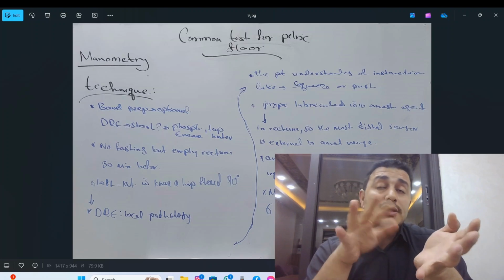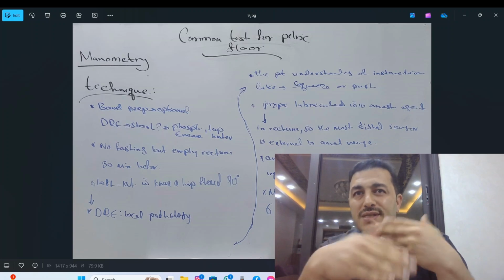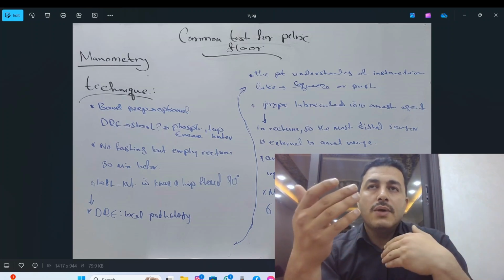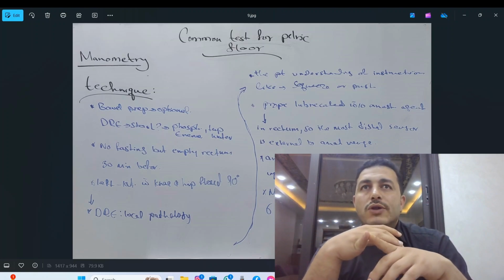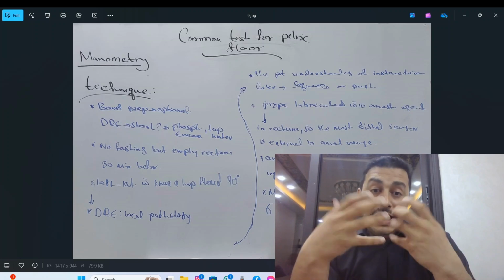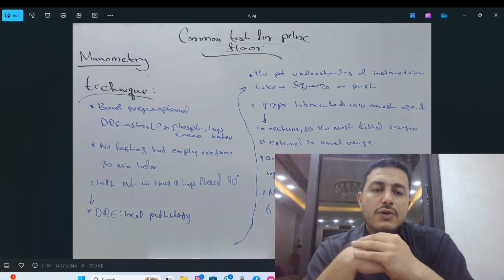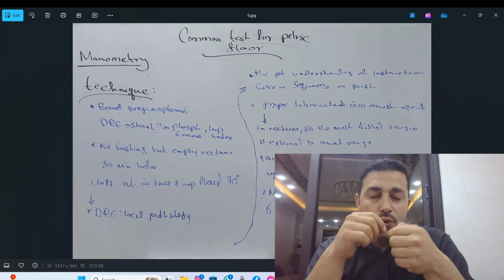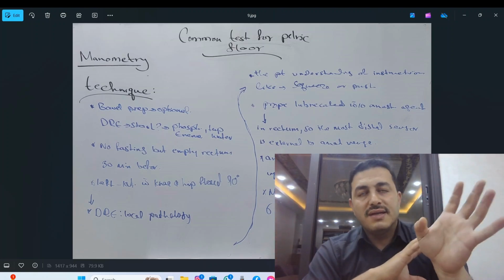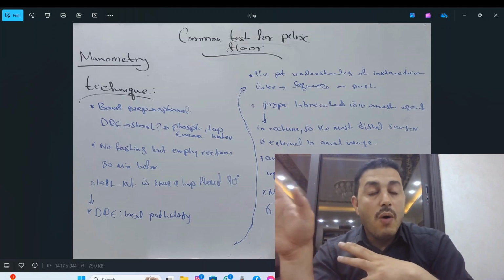The patient is positioned in the left lateral position with the hip and knee flexed. Before starting, we should share a common language with the patient. We should tell him what we mean by squeeze and what we mean by stimulating defecation, so we explain and give some instructions to the patient. The probe, when we insert it, should be lubricated, preferably with a non-anesthetic agent, because some anesthetic agents can alter our results.